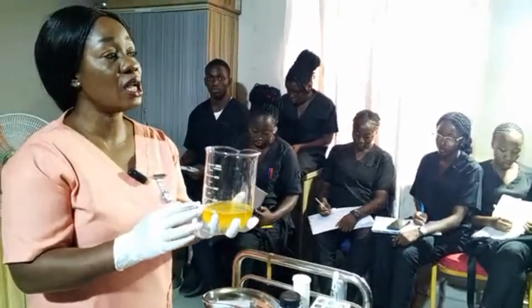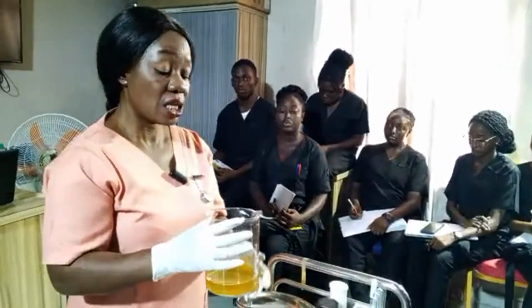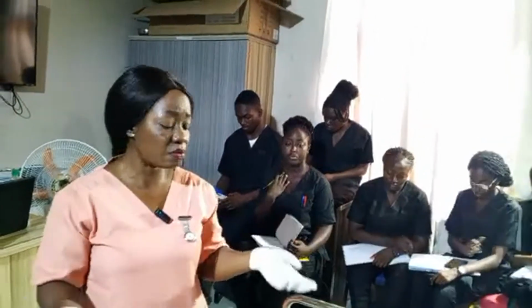So, there are different colors of urine. Sometimes you will see somebody's urine is deep amber. That means maybe the person is dehydrated. Like this our weather that is hot, isn't it? So maybe I haven't taken water, I've been in the class and I've been sweating. Definitely I will have issues.